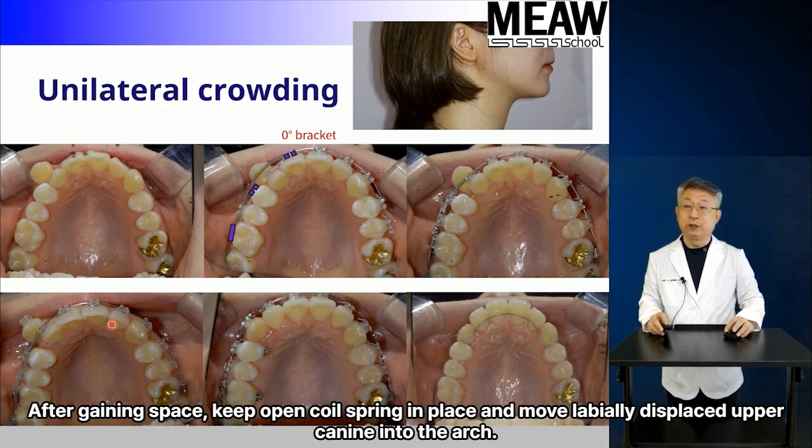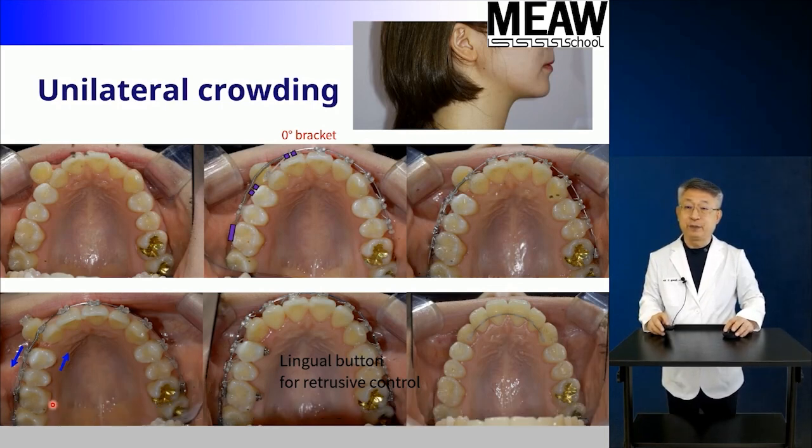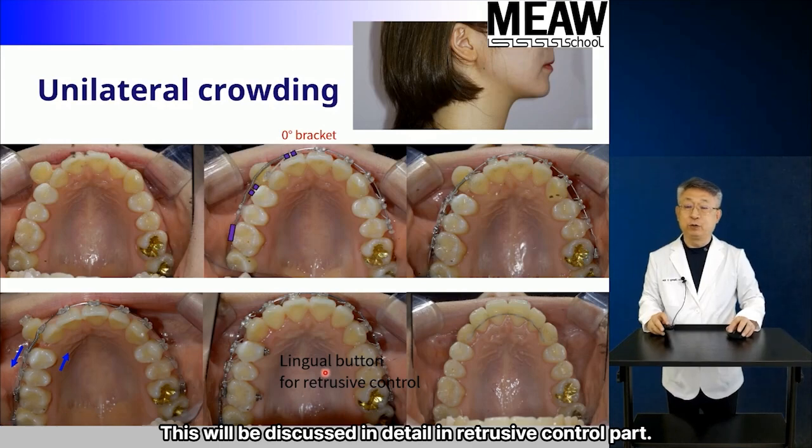After gaining space, keep open coil spring in place and move labially displaced upper canine into the arch. At this time, attach lingual button on the palatal cusp of the upper first premolar to adjust it. This will be discussed in detail in retrusive control part.